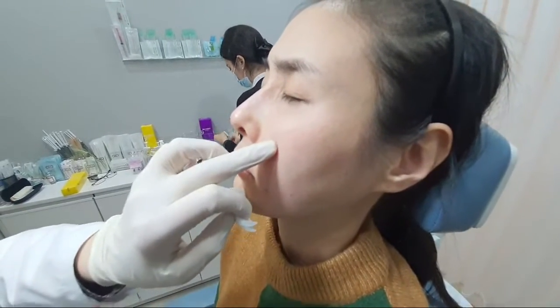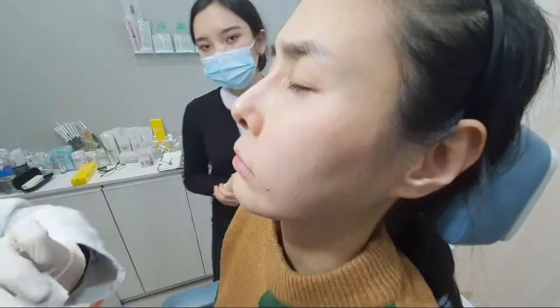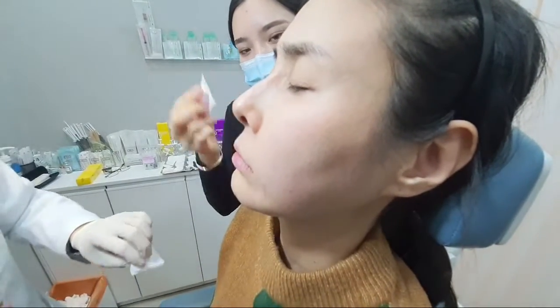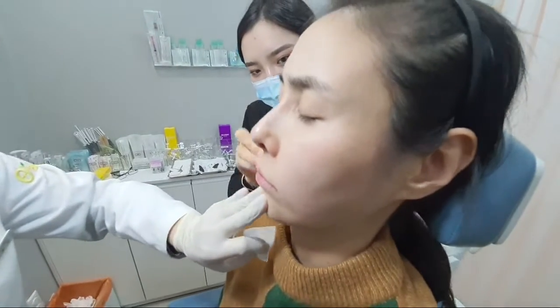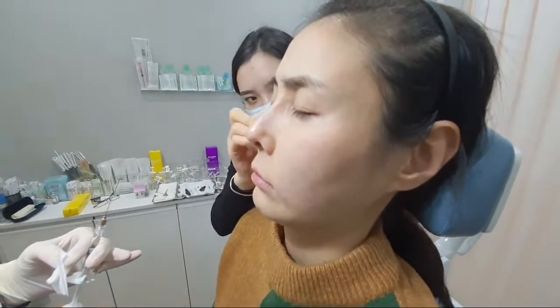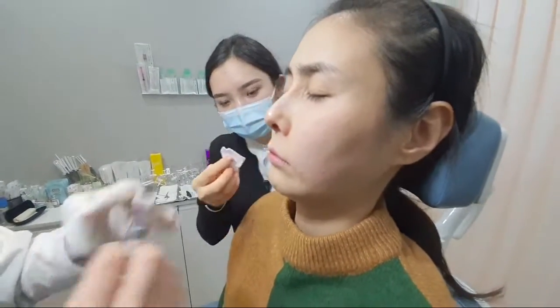지금 요 부위가 마취는 안 한 부위였는데 그렇게 통증이 심하지 않죠. Even the cheek area that he just injected in, that wasn't an area where he did an anesthetic injection. Even so, the patient didn't feel so much pain. 괜찮죠?